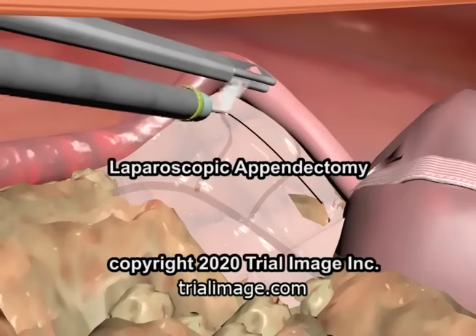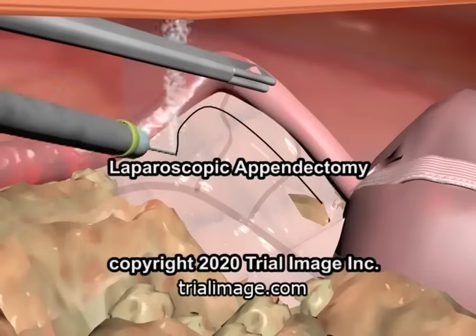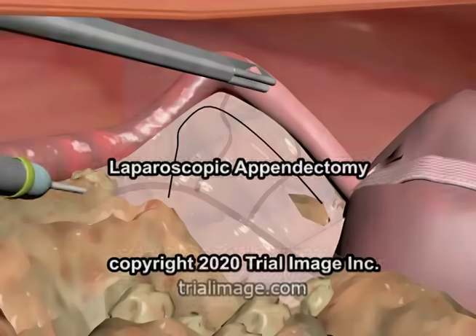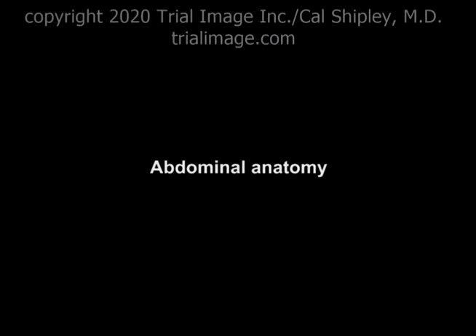This is Dr. Cal Shipley with a review of laparoscopic appendectomy. Let's start with a quick review of the relevant anatomy.